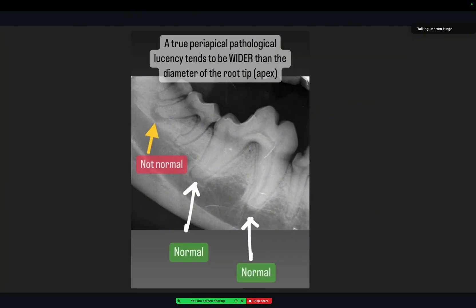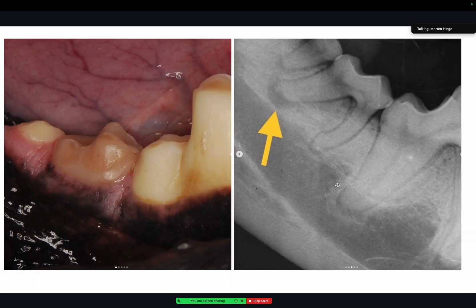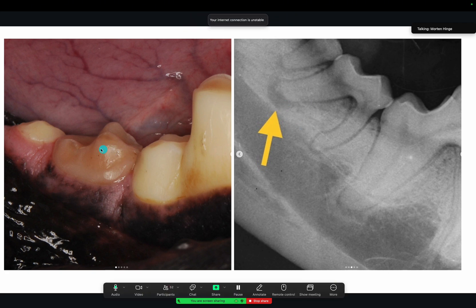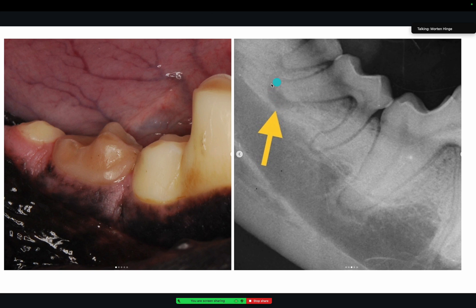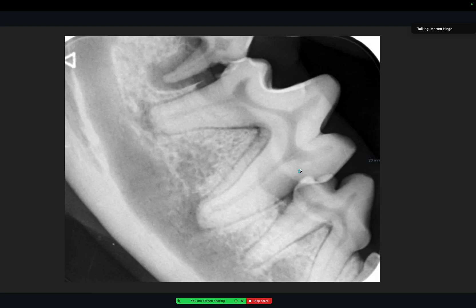Always compare with the other side if you are in doubt. Don't just send this picture to someone good at dentistry and say, is that a lucency? Send two pictures — from this side and also the other side. It's much, much easier to interpret. This tooth was discolored, and a discolored tooth is 93% of the time dead or dying. So this tooth is definitely dead, and a dead tooth can also cause endodontic disease, so you'll see this lucency here.